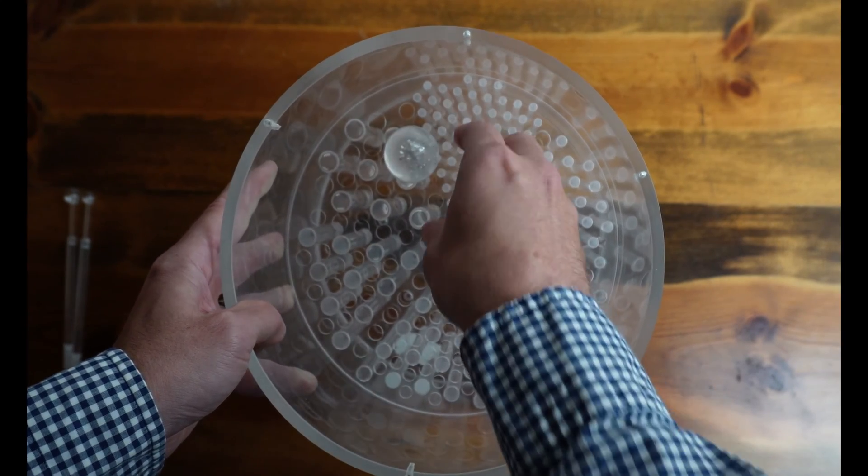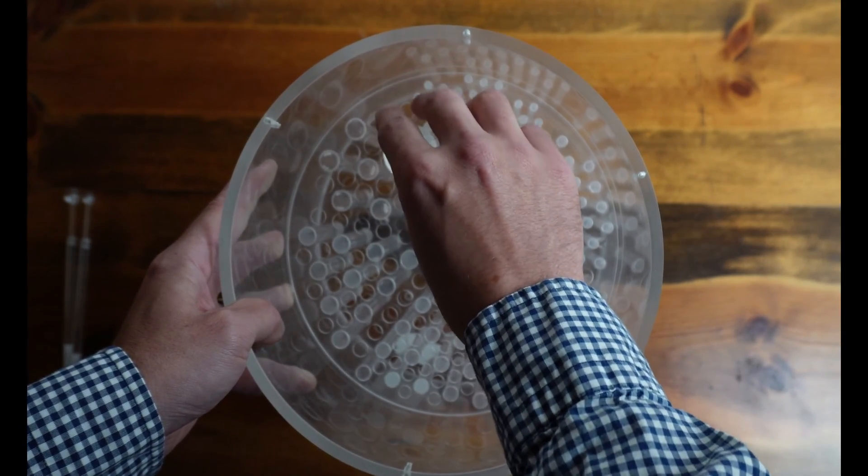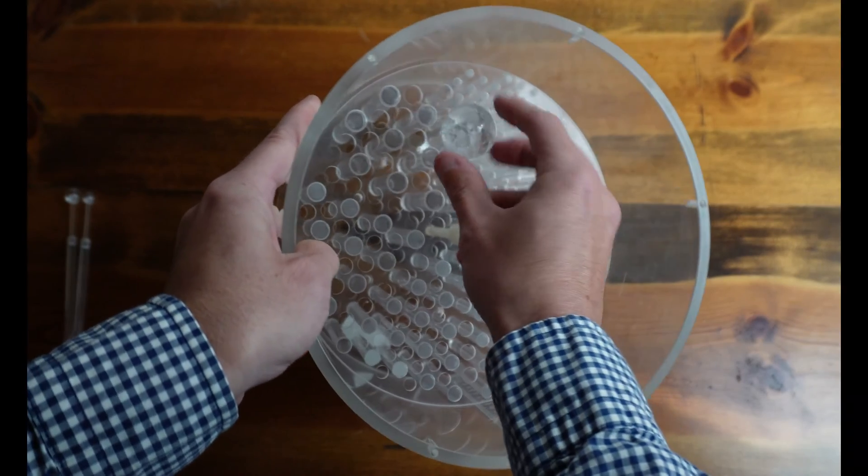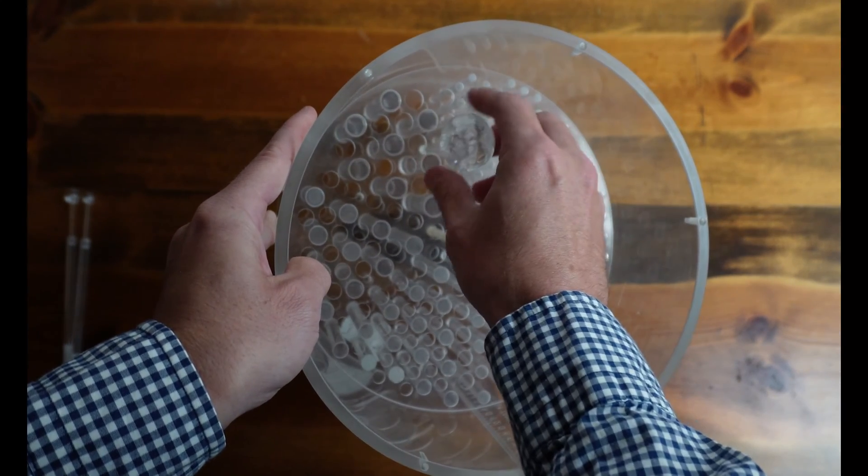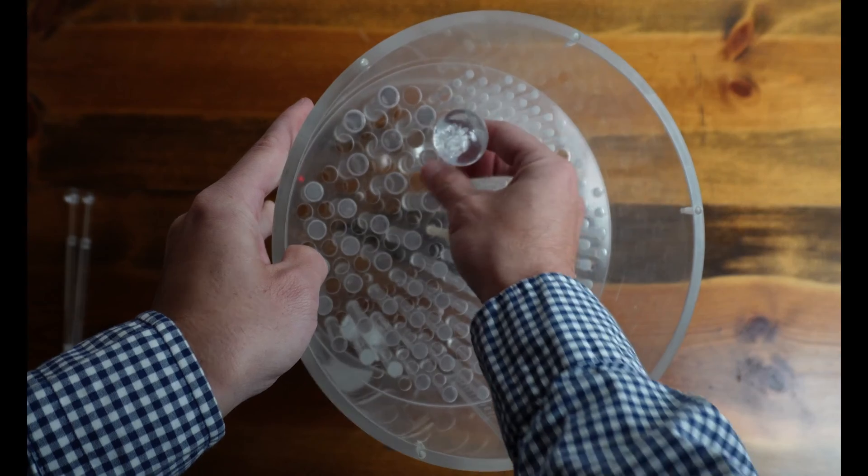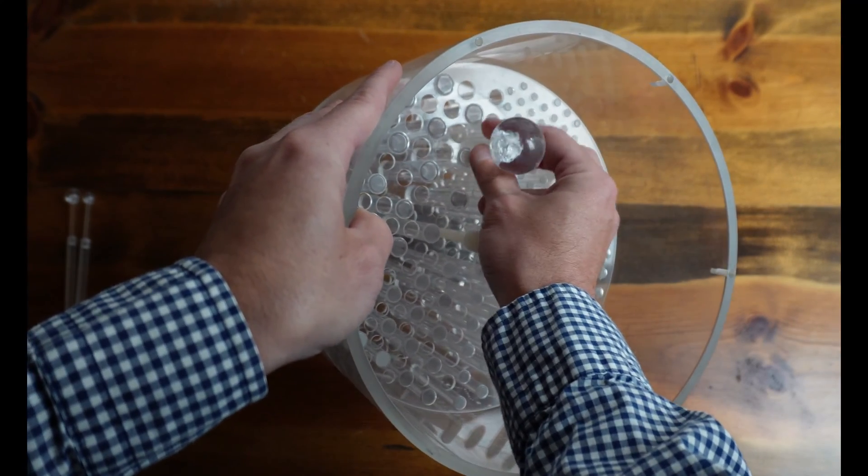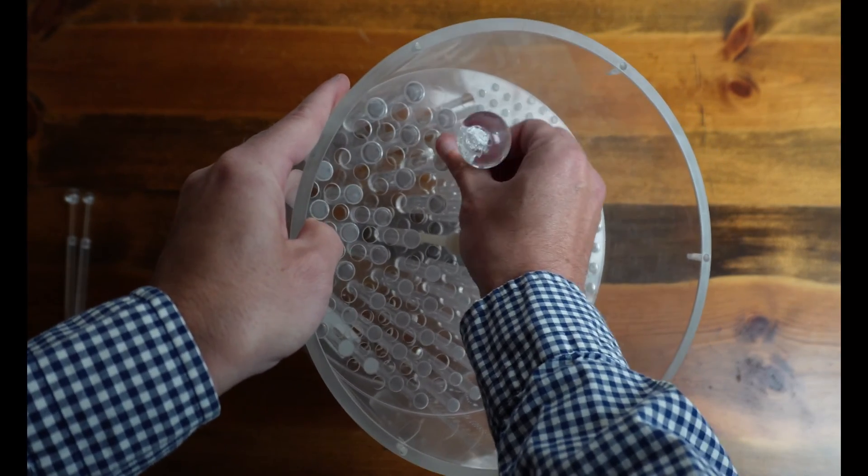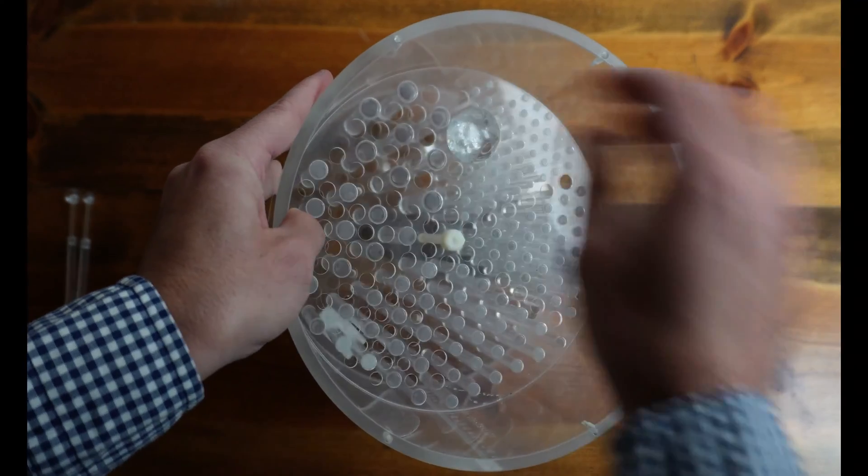I like to screw these in not by grabbing the actual sphere itself. We don't want to grab the sphere and turn the sphere because these can pop off. And so what you want to try to do is grab the stem and rotate the stem to screw the rod in.